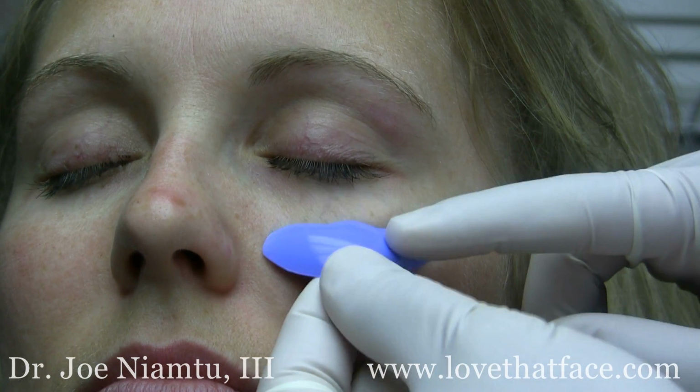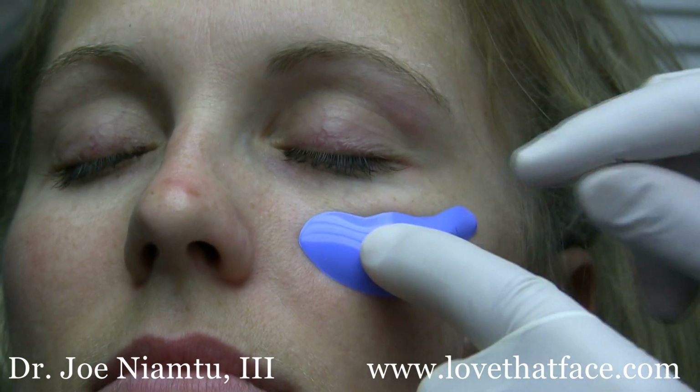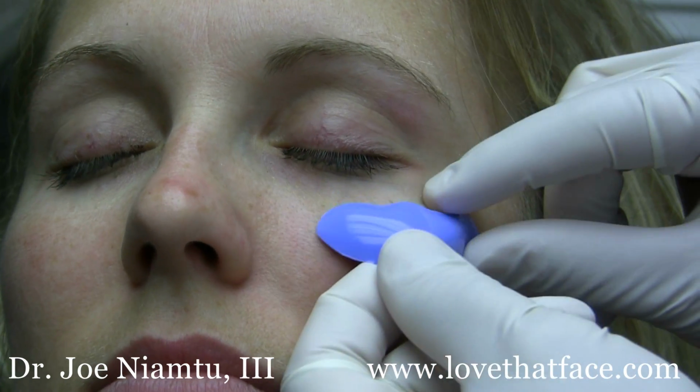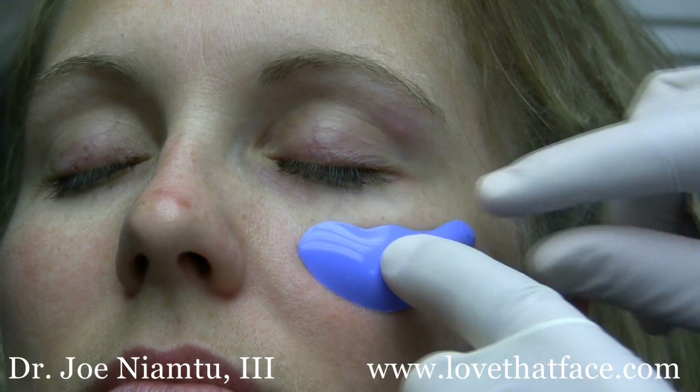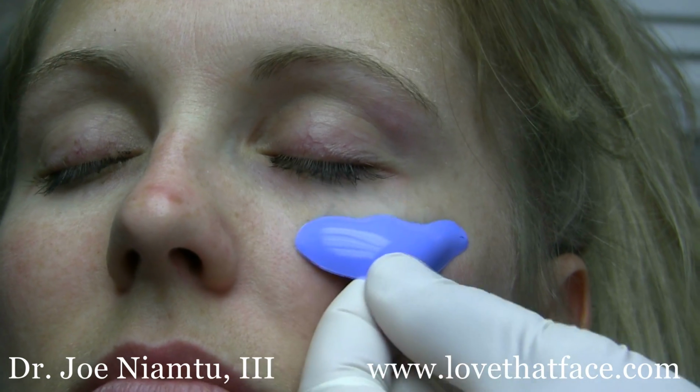All right, so what we're going to do is talk a little bit about what size cheek implant to place. So this is a young patient who has nice cheeks. Smile, relax, and actually this is what we're trying to duplicate when we do implants, this nice round cheek apple, and it tapers out this way. So being that this is a nice normal cheek, one of the implants that we use, which I use about 98% of the time, maybe 99% of the time, is a submalar implant. So it really goes from about there to there, and you can position it more medially or more laterally depending on what you're trying to achieve.